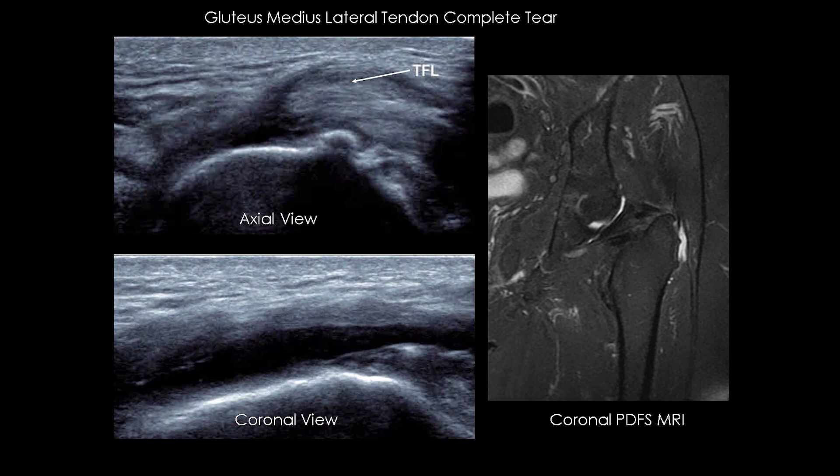Example of complete rupture of the lateral lamina of the gluteus medius. No visibility of the lateral lamina of the gluteus medius, replaced by a fluid effusion in continuity with the superficial trochanteric bursa. The corresponding coronal PD-FS MRI scan confirms the complete distal tendon rupture.